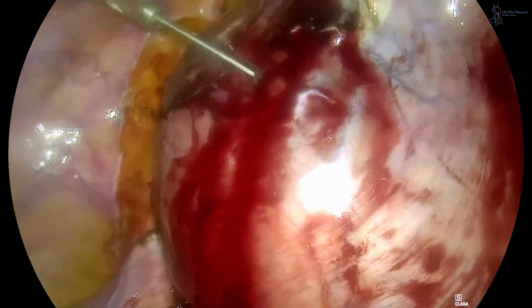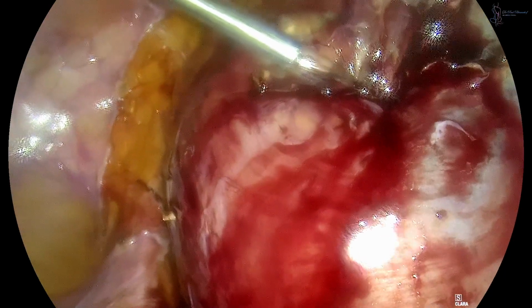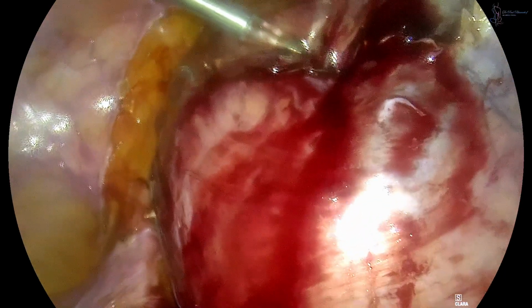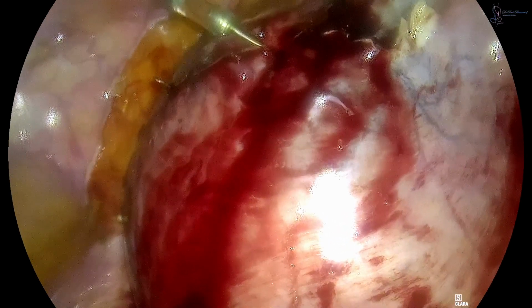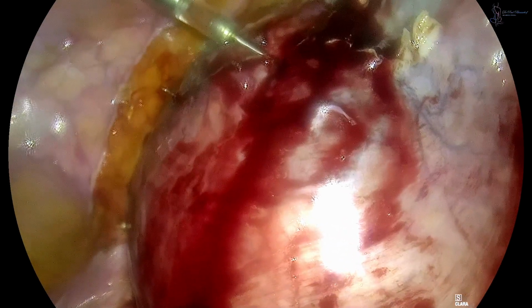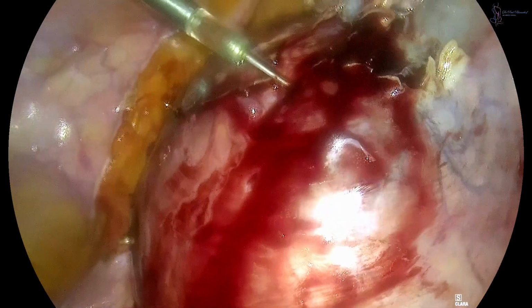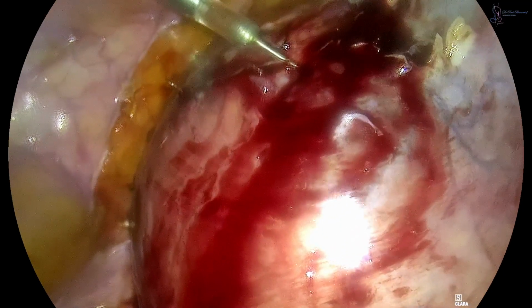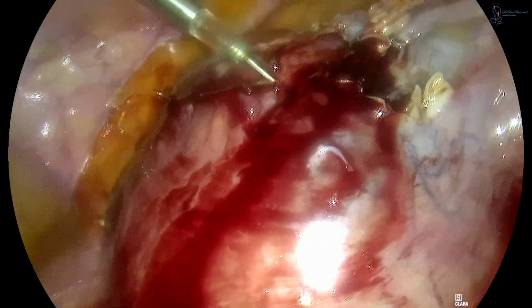An injection of vasopressin, at a concentration of 40 IU diluted in 400 milliliters of normal saline, directly into the myoma. This procedure aims to reduce intraoperative bleeding by causing vasoconstriction of the surrounding blood vessels. The solution is carefully injected into the myoma tissue under sterile conditions, ensuring precise administration to achieve optimal hemostatic effect.